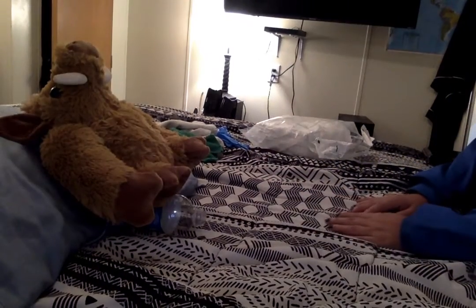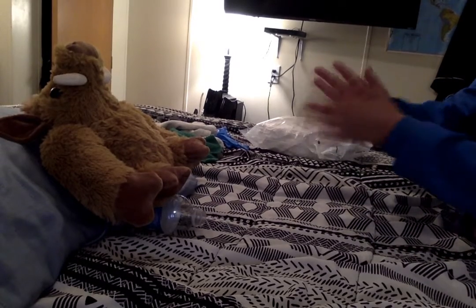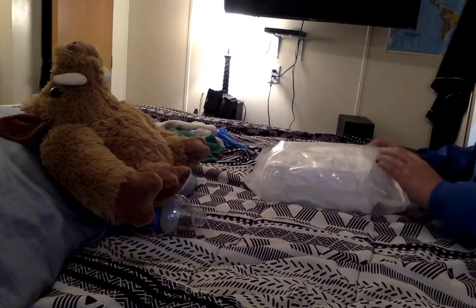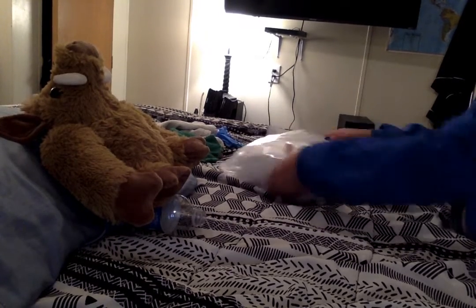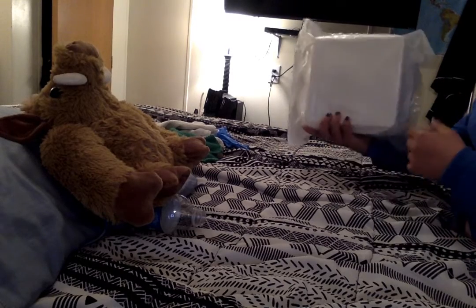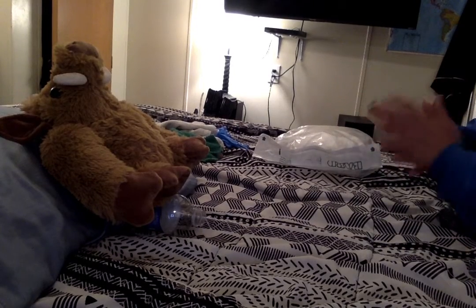So the next thing I'm going to do is go find a catheter that matches the doctor's orders. We're always going to want to use the smallest catheter possible for our patient. We're going to perform hand hygiene and find our catheter. We're going to make sure this is the right one and compare it to the doctor's orders, making sure it's the right size. It says yes. We're going to make sure that it's never been opened before, and it hasn't. We're going to perform our hand hygiene.